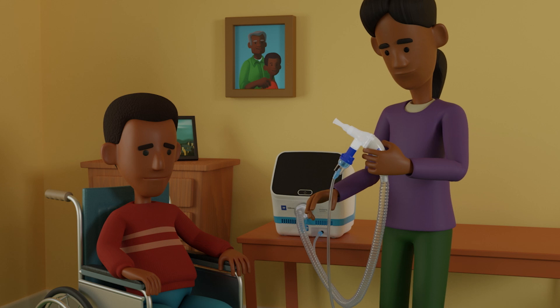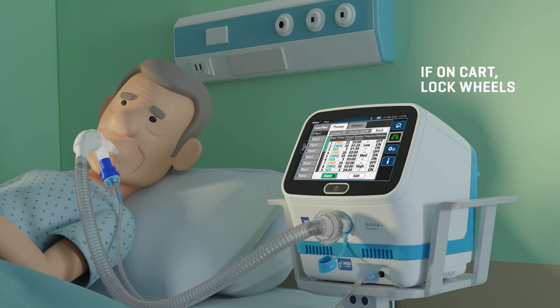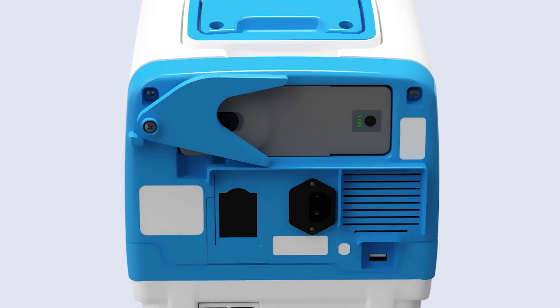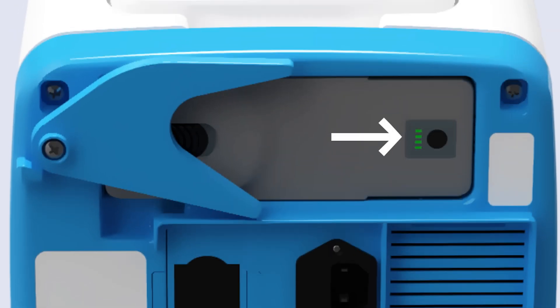When setting up the device, make sure that it's placed on a flat hard surface, or if it's on a cart, that the wheels are locked. The control unit can be run with the AC power cord outlet or using the optional rechargeable battery.